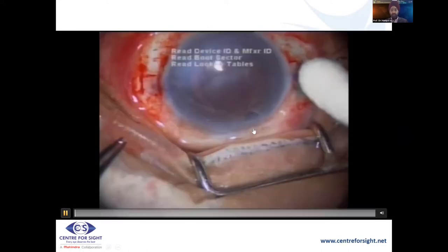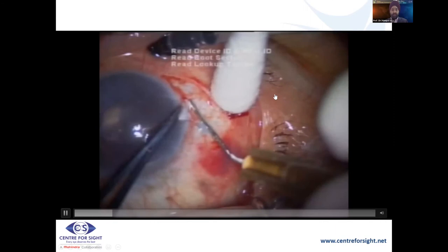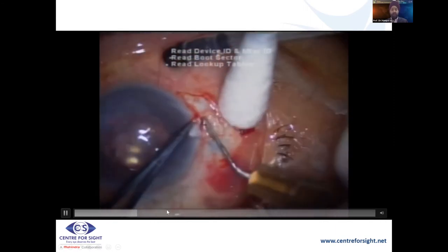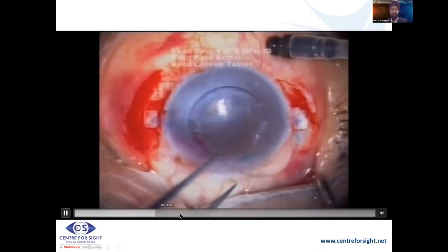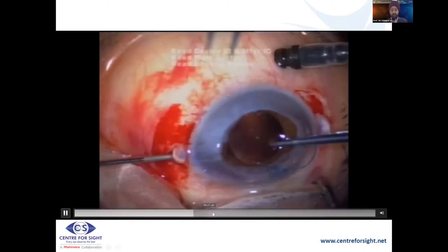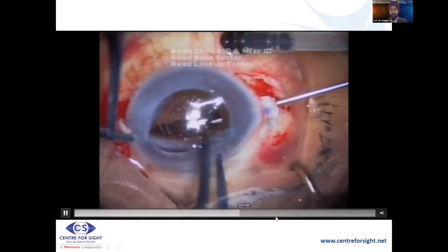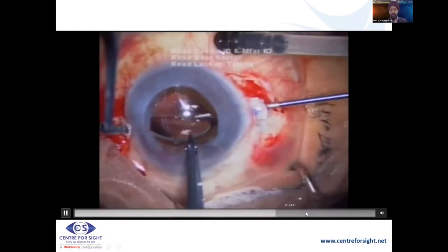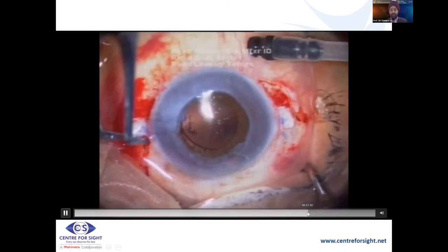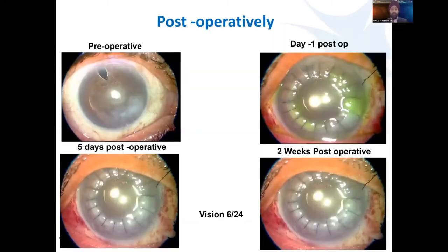Here's a case where there was an anterior chamber lens with pseudophakic bullous keratopathy. It's always better to make the scleral flaps first so you're on a tight globe. This is an open-sky case — the Kelman multiplex lens that was put in earlier. You go in and pull out one of the haptics; MST forceps are pulling out the haptic. What I wanted to show is that you can combine this with penetrating keratoplasty. You push in the haptic and complete your PK. The preoperative picture versus postoperative shows visual recovery of 6/24.